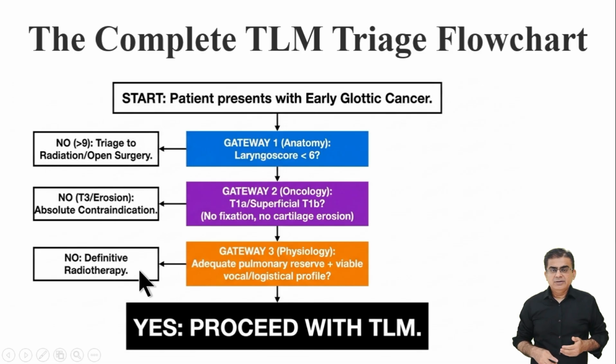But look at the bottom of the screen. If a patient successfully passes all 3 gateways, you have the absolute green light. You can safely and confidently proceed with transoral laser microsurgery.